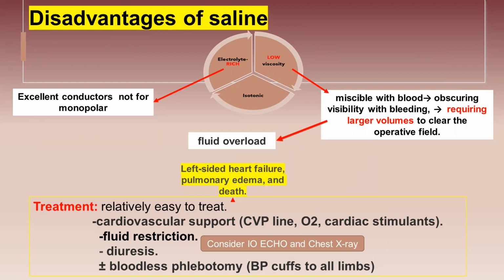Some studies put sphygmomanometer cuffs on the different limbs of the patient to minimize fluid overload to the heart. And we have to consider intraoperative echocardiography and chest X-ray to exclude pulmonary edema or cardiac changes.